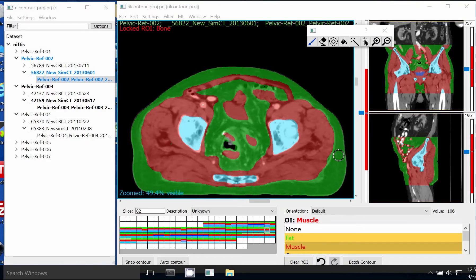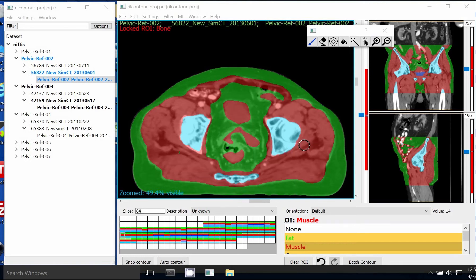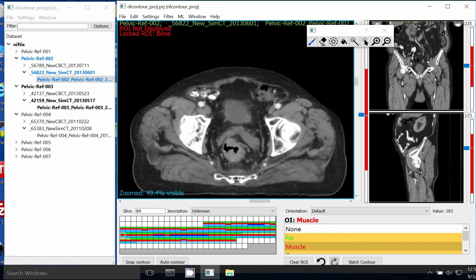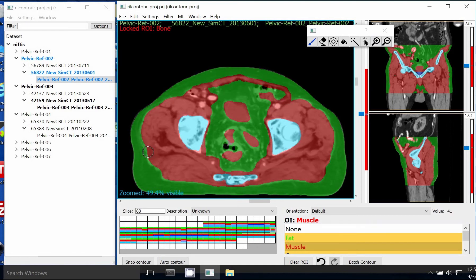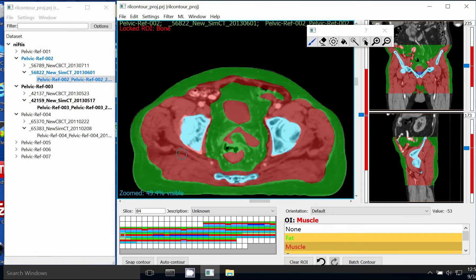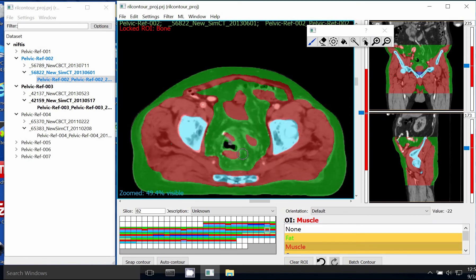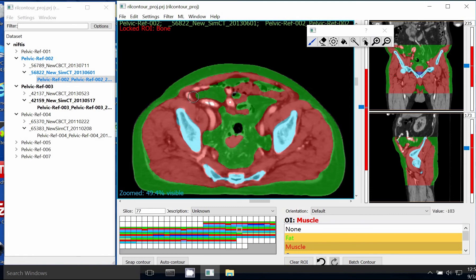We finished correcting just a few small problems with the muscle. Firstly, you can see I was very explicit about segmenting the abdomen wall — this is a feature that the model is tending to miss, so we want to be very explicit about correcting that, even at the risk of over-segmenting. Another issue: this is a frail patient, probably a little bit older. You can see there are some fat deposits in the muscle that are being traced as green. This is something we actually want to measure — we want to be able to tell how fatty this muscle is, so we're going to correct that as red. Next I'll be correcting the organ, which will probably take a couple passes. I'll start by freezing the green and correcting the red, then go back for a second pass and correct the green.